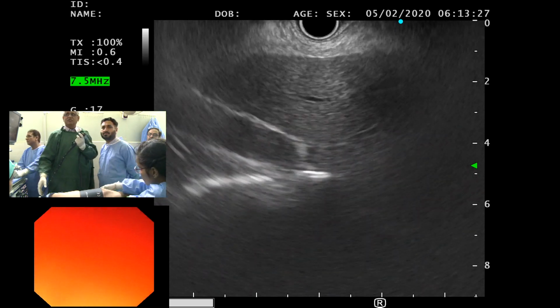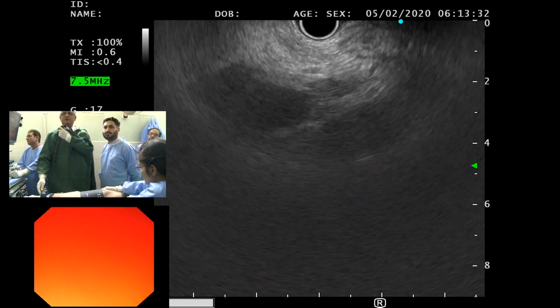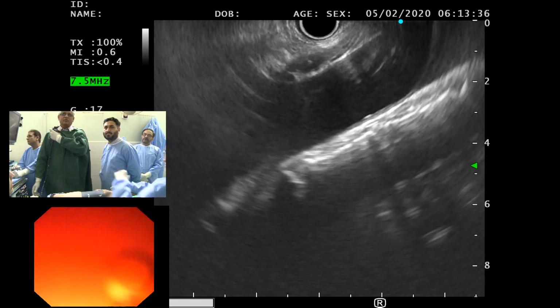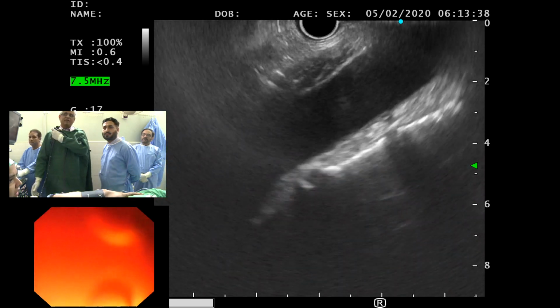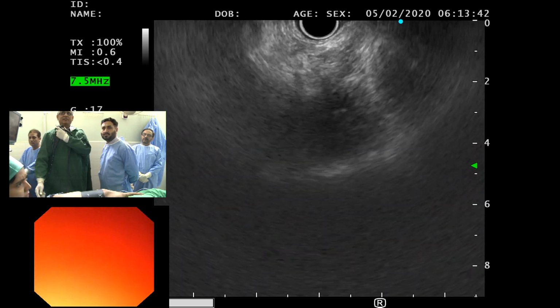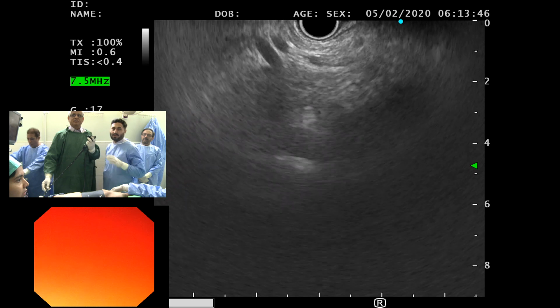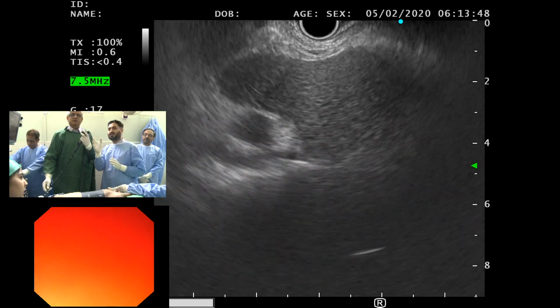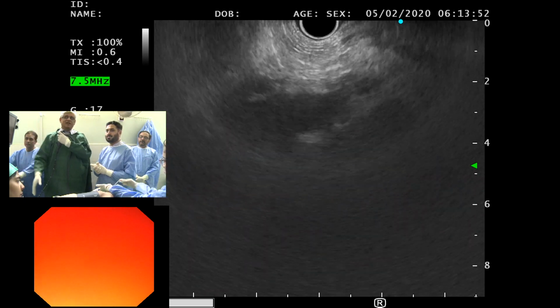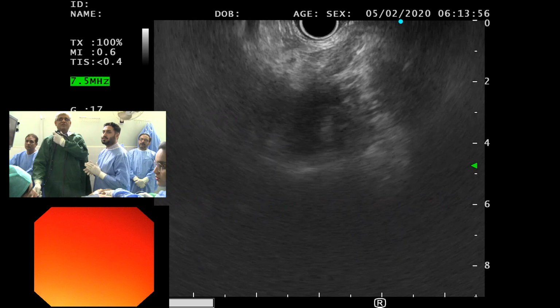Usually the GE junction is at 35. So go 5 centimeters, gently anti-clock rotation. We have both the vessels, right? So we have the celiac takeoff there, and we have the superior mesenteric. So if you want to take back and try and do that quickly. We are not going towards the pancreas yet, right now we are just focusing on the aorta. Okay, now the aorta has come, now we have to go towards the pancreas.